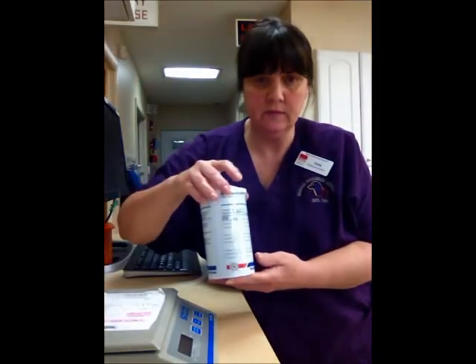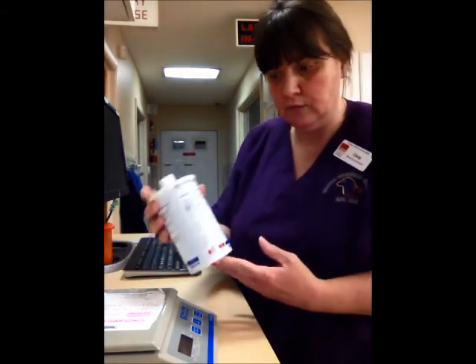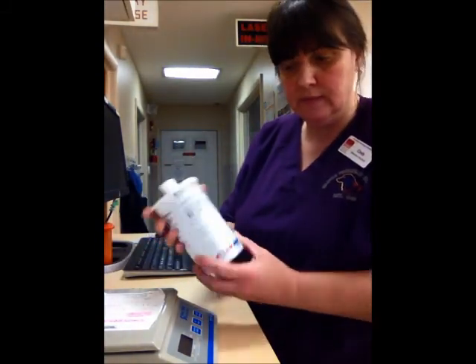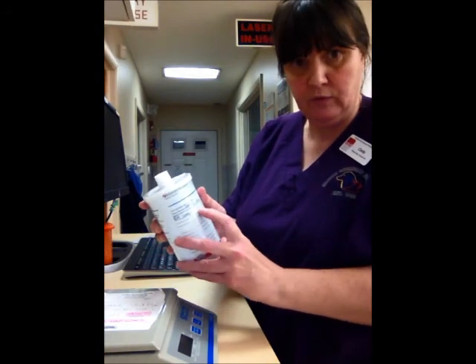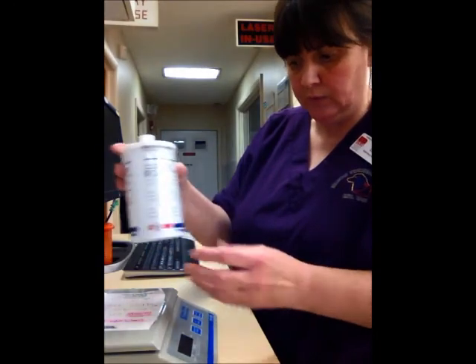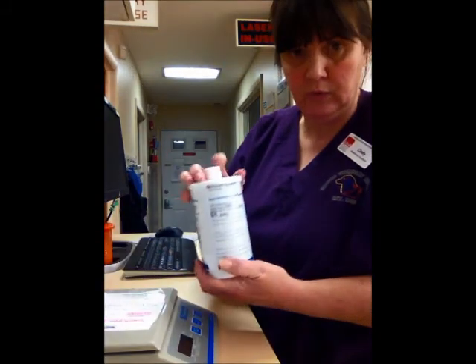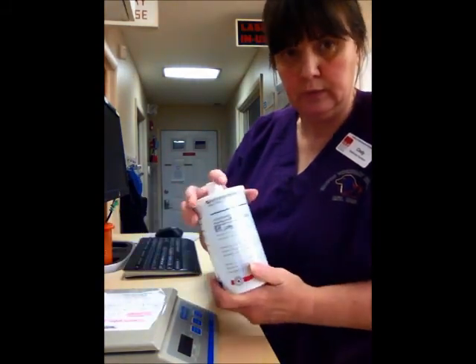We have a passive scavenging system, and every day after surgery it gets weighed to see how much waste anesthetic is in it. It only holds about 50 grams of waste anesthetic, so after that it is full and no longer can accumulate. So we just weigh it every day to see how much gas has accumulated.